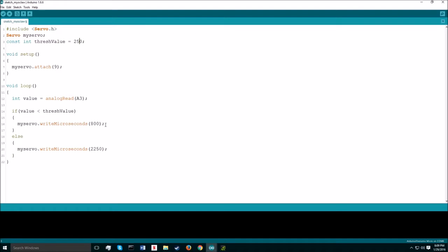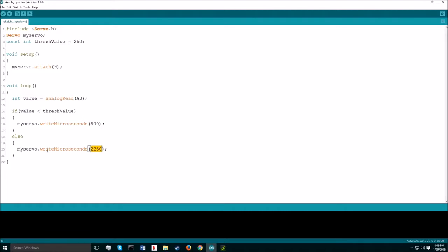To move the servo, I chose to write in microseconds. This best suited my needs. So, if the value is not less than this thresh value, then it will go to the else and move to this position here.